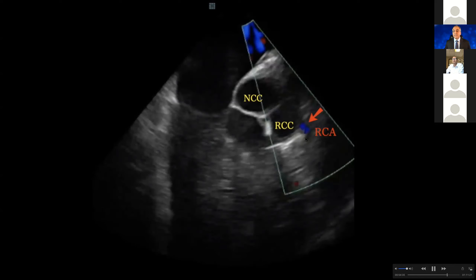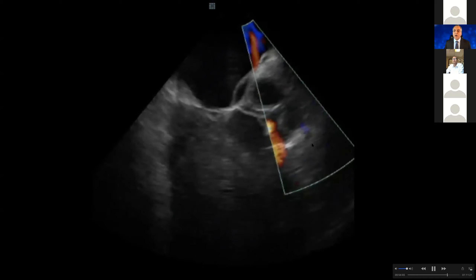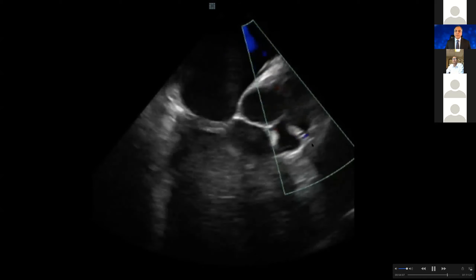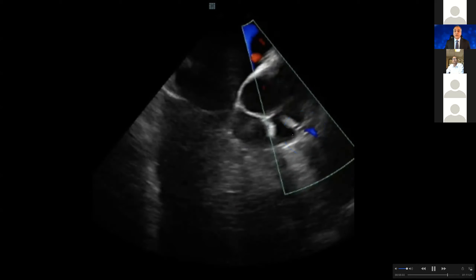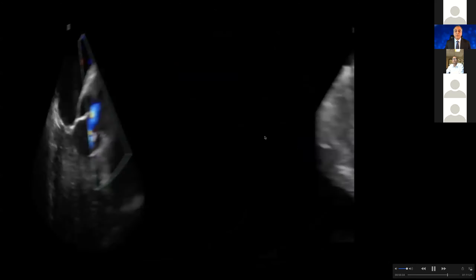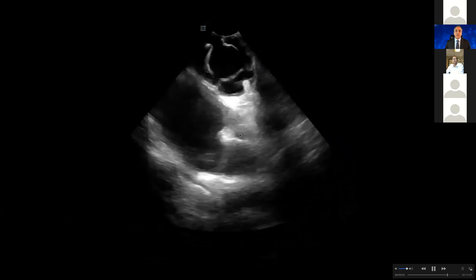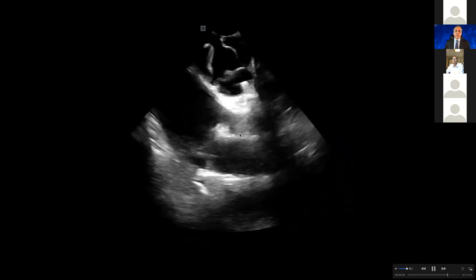So here you can see the RCA, and as mentioned, if you go ahead and advance your ablation catheter towards this RCA, you can tag it on your mapping system. Just quickly put it at the ostium for a second or so and tag it. I have seen some physicians try to do a U-curve in this area, and there is a likelihood that you can dissect these arteries. So if you are very careful and look at it, you can just put it and tag it.